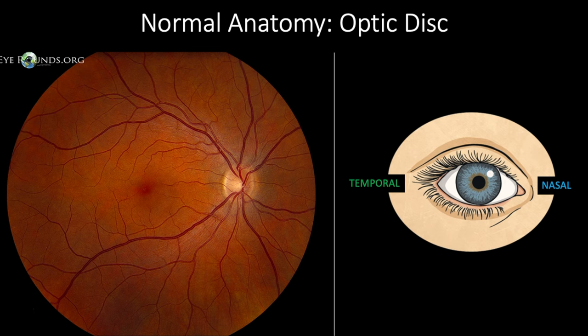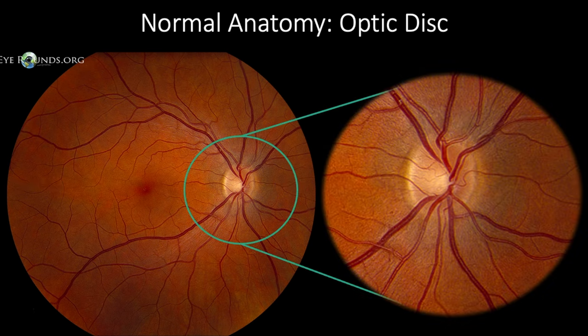Let's start with the optic disc. The optic disc is located nasally, thus by looking at the image provided we can establish that we are looking at the patient's right eye. When looking at the disc we should assess its color, contour, and sharpness. The disc should be pale pink, approximately 1.5 millimeters in diameter, with sharp and flat margins.